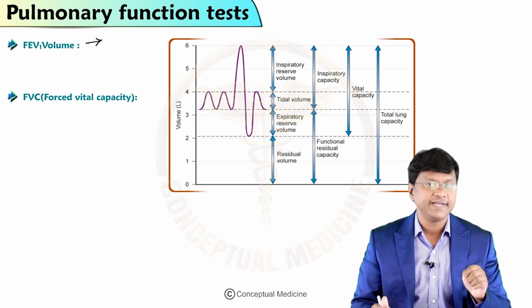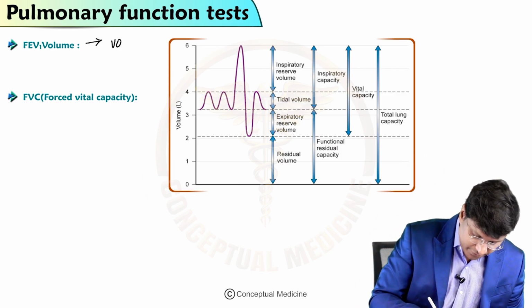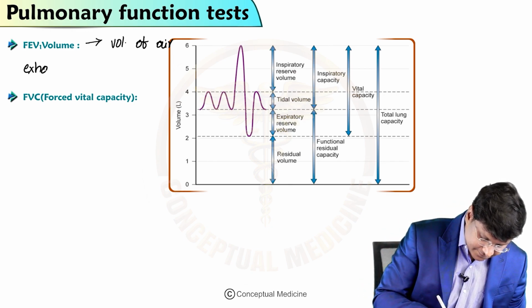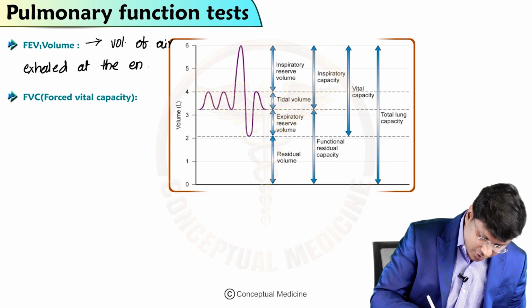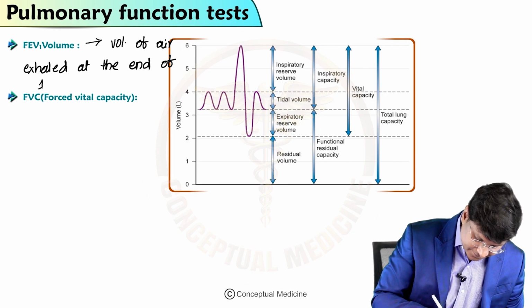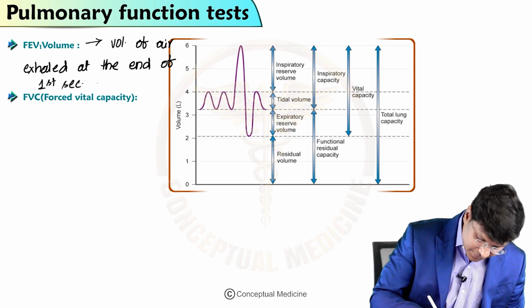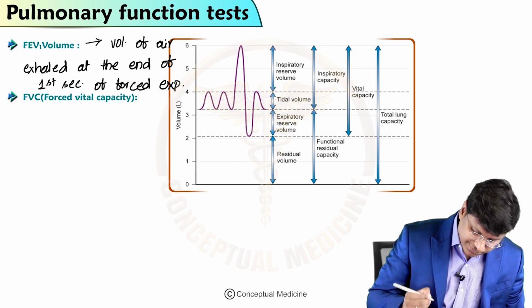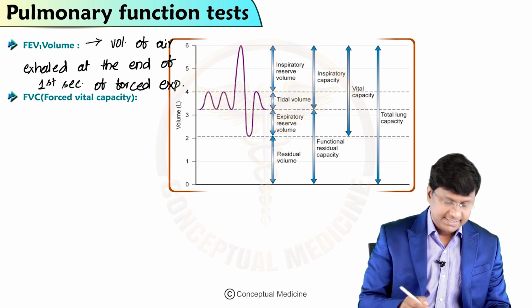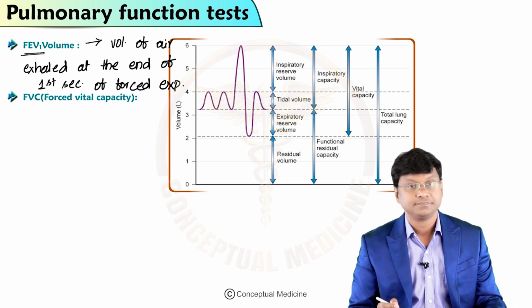FEV₁ is defined as the volume of air exhaled at the end of the first second of forced expiration. That is what is called FEV₁.